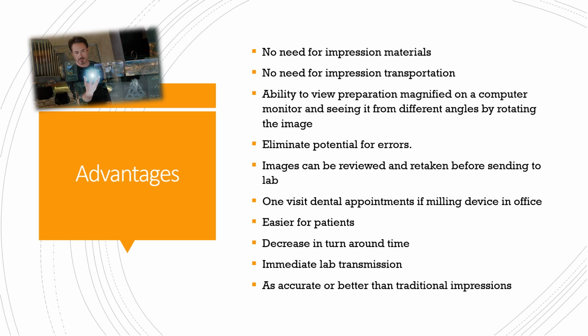There's the ability to view the preparation on a magnified computer monitor to make sure that you have everything that you need. Okay, you are able to rotate that image, which allows you to evaluate it to make sure everything is correct before you send it to the lab.